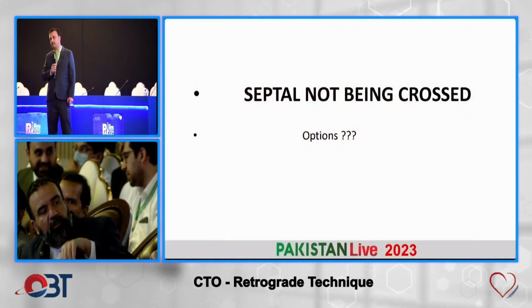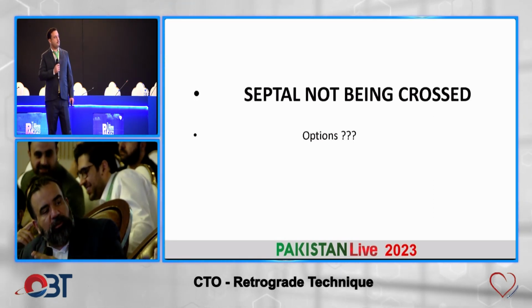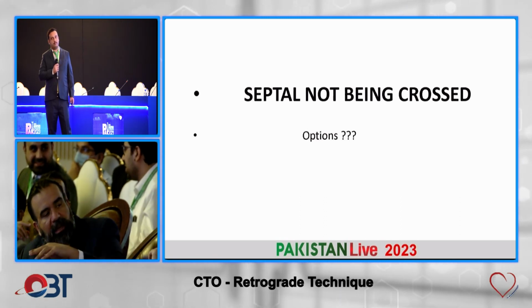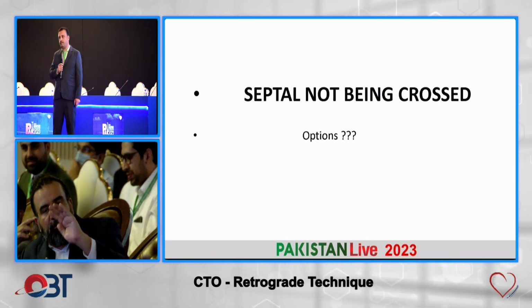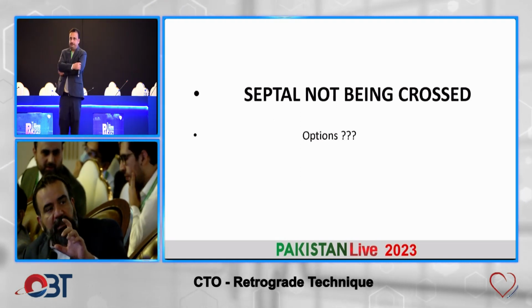Now the only caveat there is that sometimes you have a big first septal, but then it has multiple branches. And then you can use the tip injection to direct yourself into those branches, right? So you've got 4 branches, you've got the first mini, then the second one, the third one. You can do that. So usually for directed septal surfing, the first and second septals are great for that.